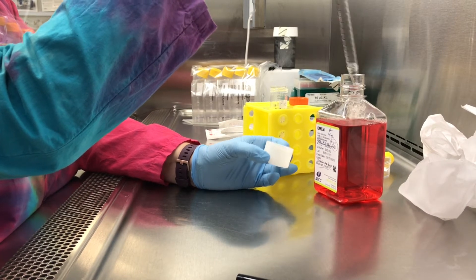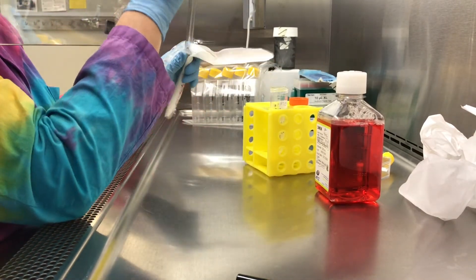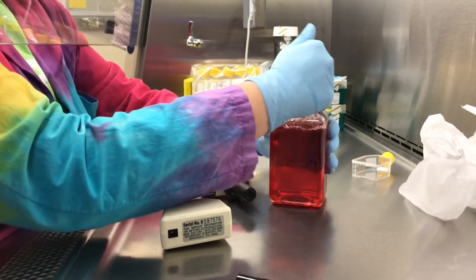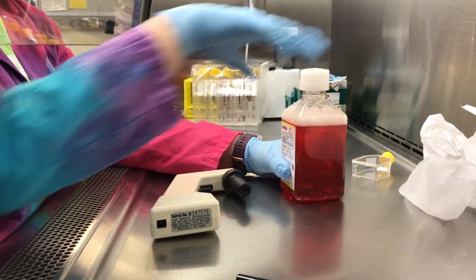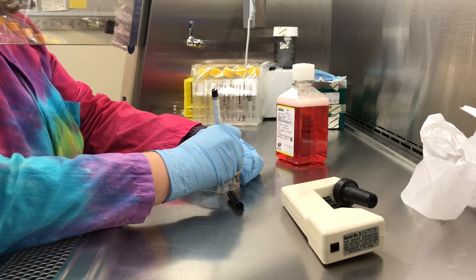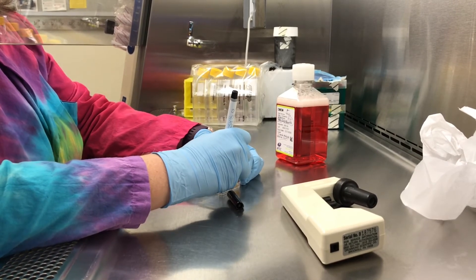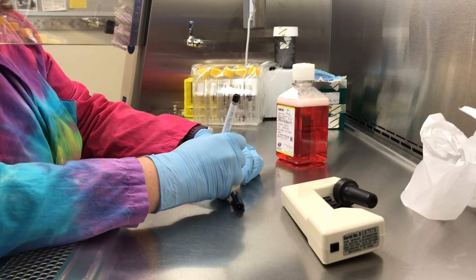After I've added the serum, I dispose of the tube and might record the lot number if I'm concerned about it. Then I give the media a good liberal shake. A useful tip: if you ever wonder whether you added serum to a bottle, shake it — if it foams like that, you've definitely added serum. In unsupplemented media it won't foam; it'll just settle out really quickly. Then I'm labeling a flask for the sterility test, adding media to it, and putting today's date on there.